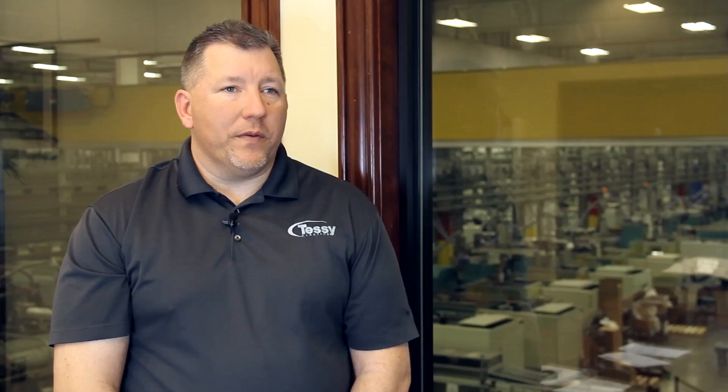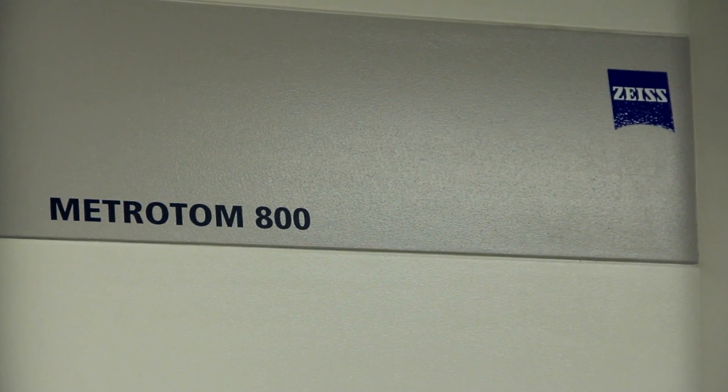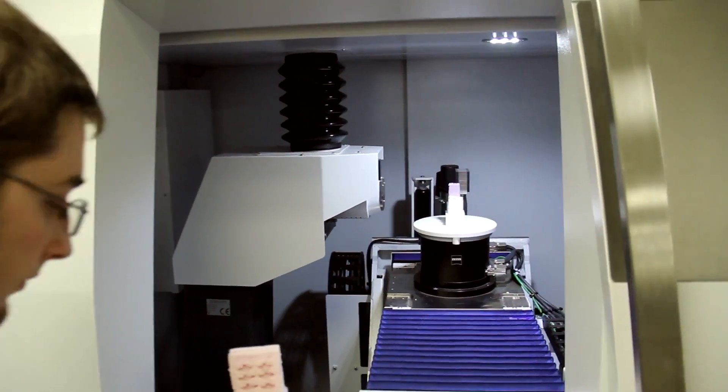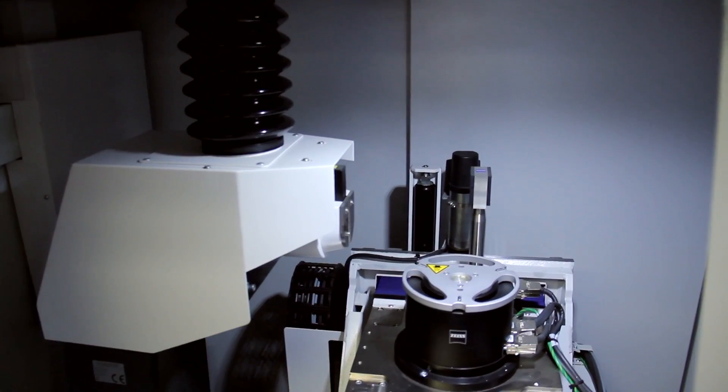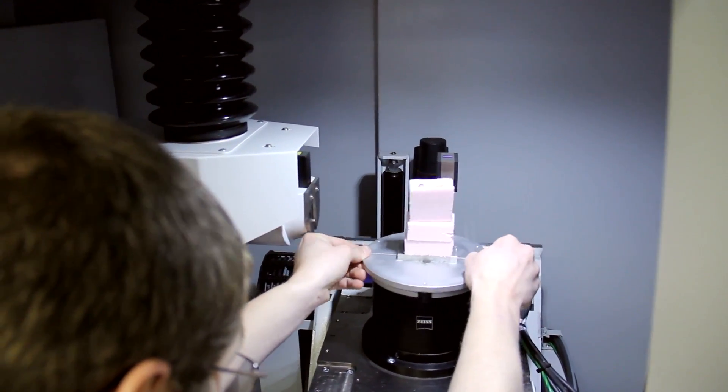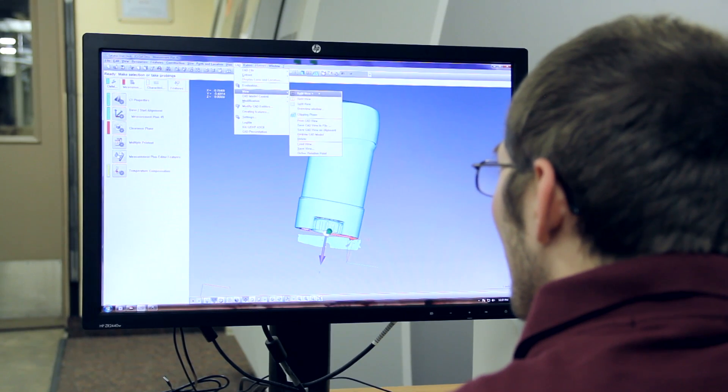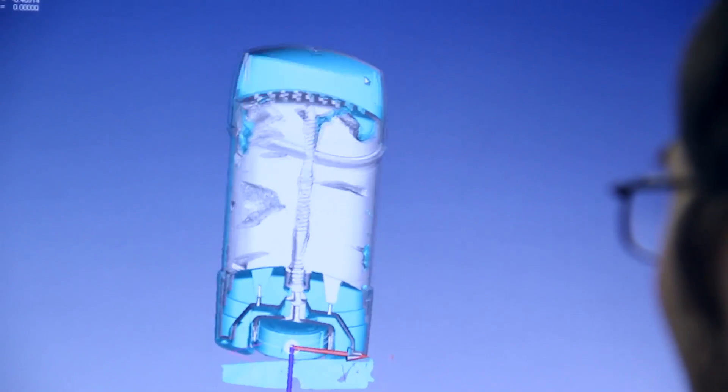We use the metrotom primarily for doing first article inspections on very complex small geometries for the medical device industry. We also use it for scanning assemblies and dissecting assemblies, so you take a scan of an entire canister or a cap enclosure and see potential leak paths, if they're leaking where it could be coming from, or potential interferences where you could be binding or increasing torque or pull.